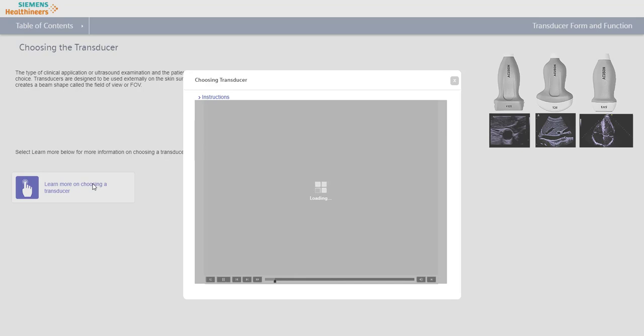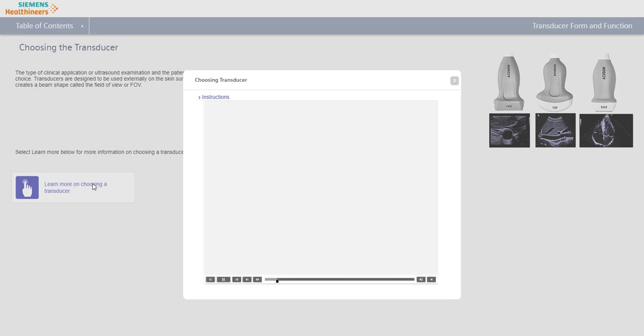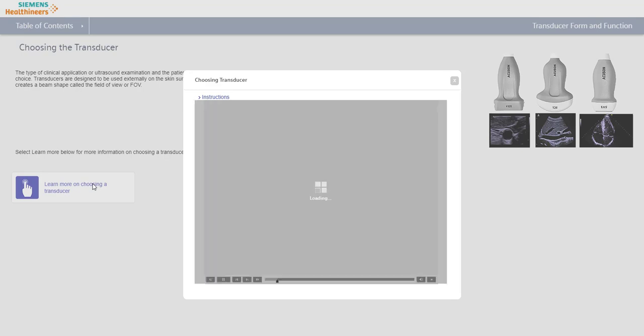Musculoskeletal (MSK) ultrasound is a versatile application, and the linear transducer is a good choice for both the upper and lower extremities. The majority of MSK examinations require shallow depths and fine detail, so a high-frequency linear transducer with a small footprint is the ideal choice for musculoskeletal exams.